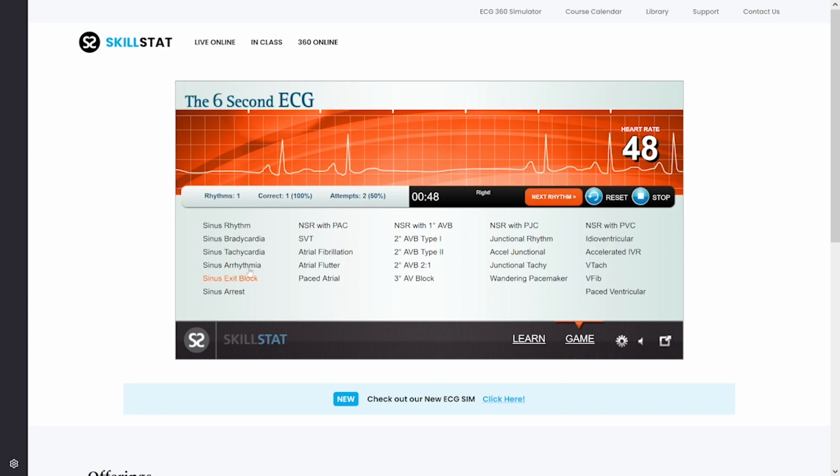I've never really had to learn this through medic school. And I think if you're a cardiologist or somebody who works in a cardiac ICU, you should know this rhythm. For me personally, it's not really the end of the world to not know it. So I'm okay not knowing it.